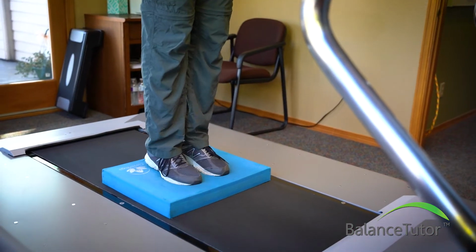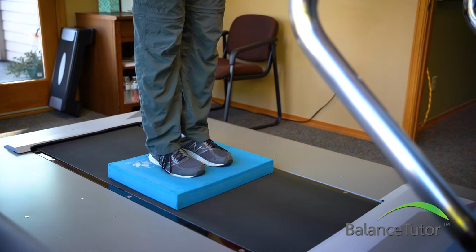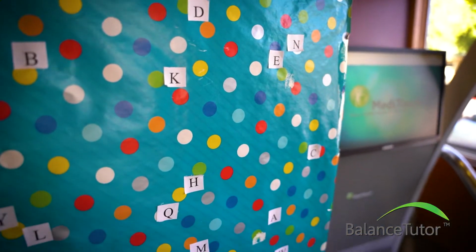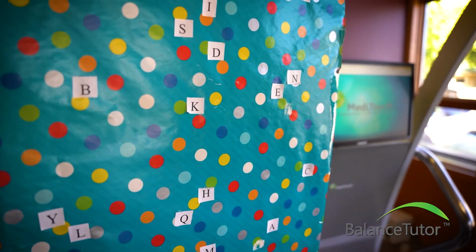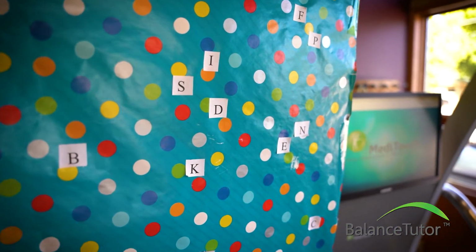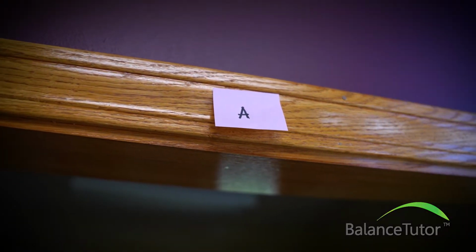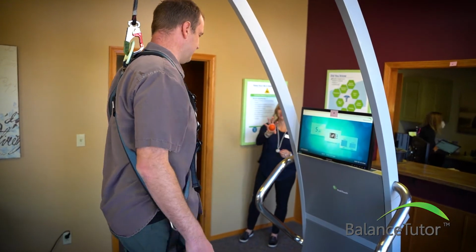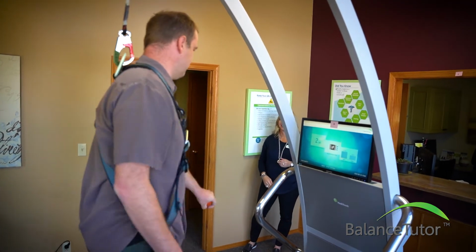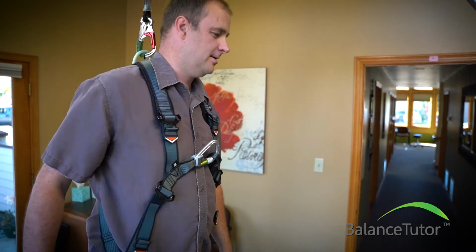We can also use outside equipment in addition to this treadmill, so it doesn't get boring for the patient. We use busy boards that have wrapping paper on them and numbers that we can flash at them and have them call out the alphabet or numbers. We also use aids that are around the room. They have to turn their head and look at it. So a lot of head turning. We bounce balls at the patient that they have to catch while there's a perturbation going on the treadmill. The patients can walk forward or backwards. So there's lots of options.